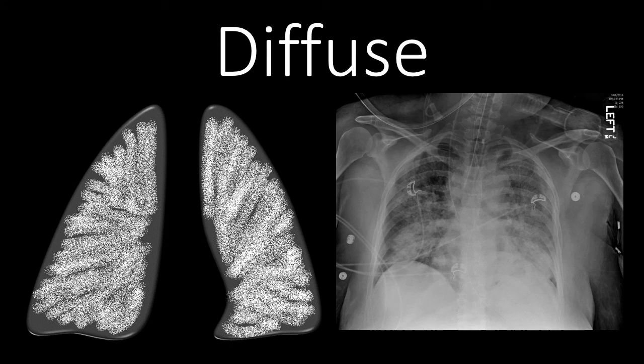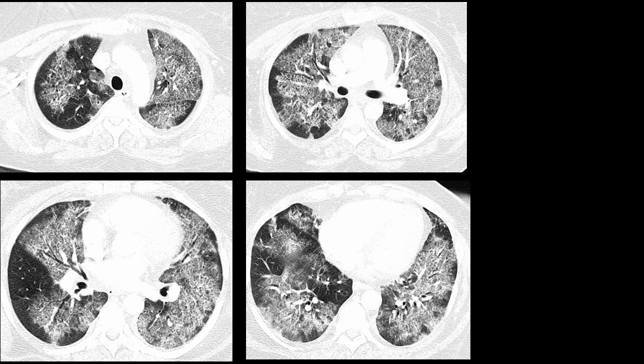I've provided a graphical representation of what I think of as a diffuse disease process, and an example of a person with a diffuse disease process on chest radiograph. You can see in the graphical representation and in the radiograph that the upper and lower lungs are involved, and it's relatively uniform in terms of that involvement. On the chest CT in this same patient, the pathology in the upper lobes is pretty similar to that in the lower lobes, with no upper or lower lobe predominance.